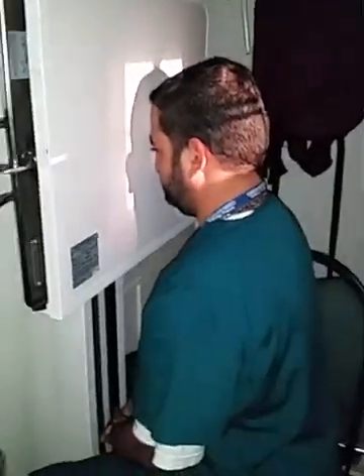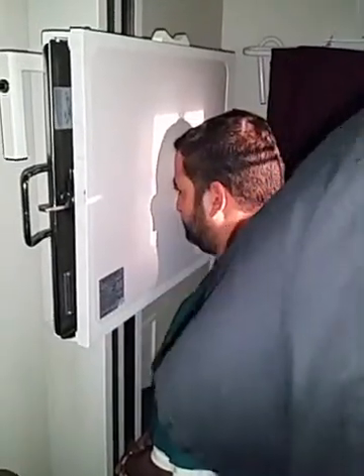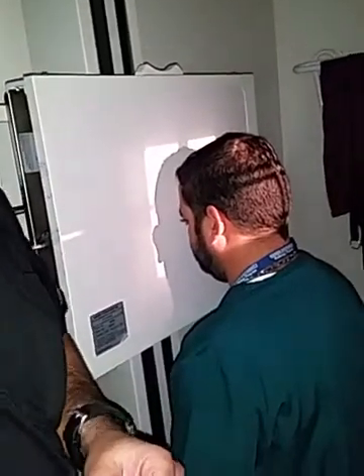What marker do you like? You can put either left or right, it doesn't matter. I don't care, just so long as it's not in the anatomy. And of course, you've got a nice area up here and a nice area over here, which just begs to put a marker.